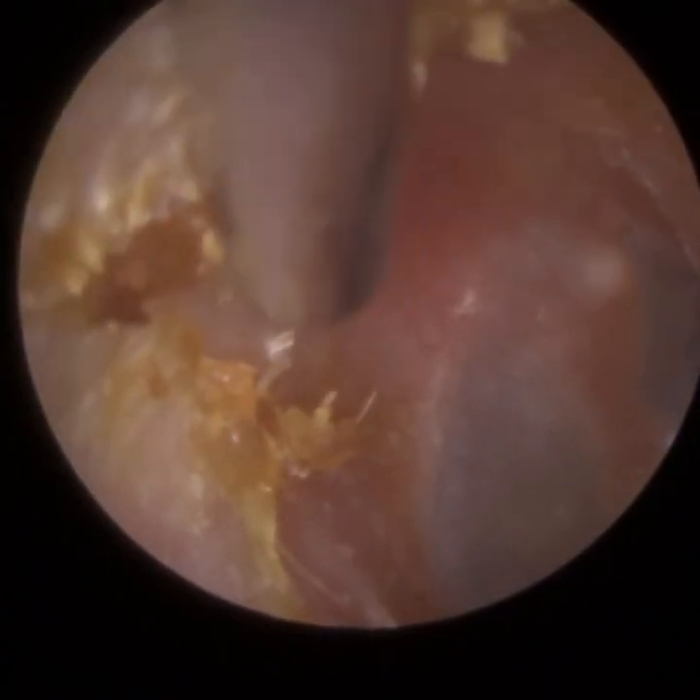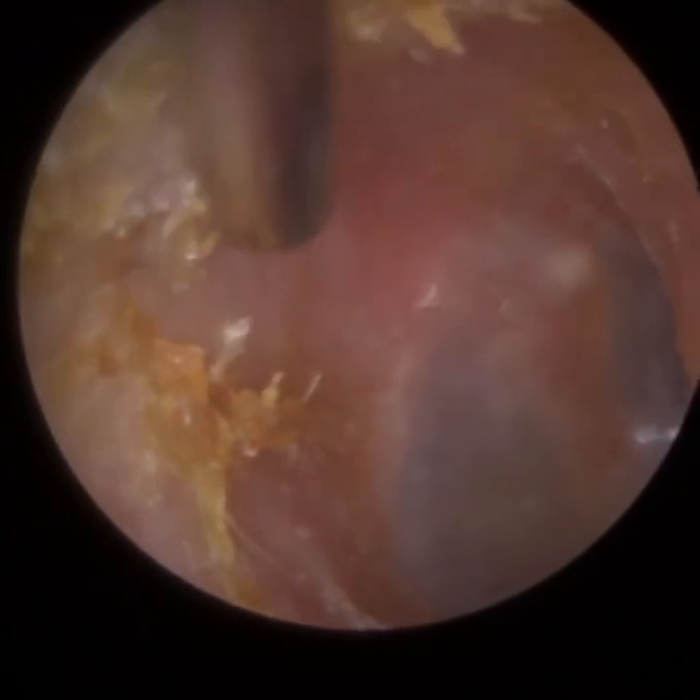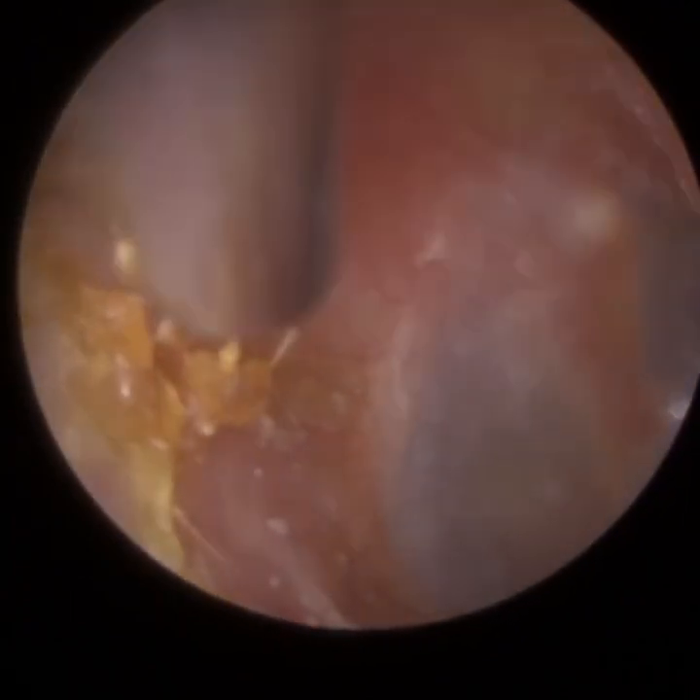It carries them at the roof of the ear canal and the posterior canal wall — that's the back part of the ear canal. Just using a fine end gauge to gently suction that off.